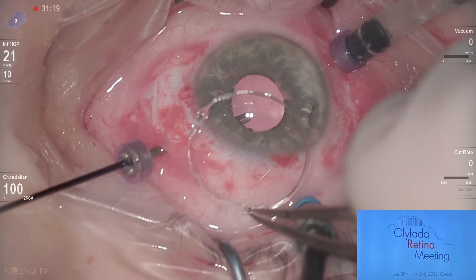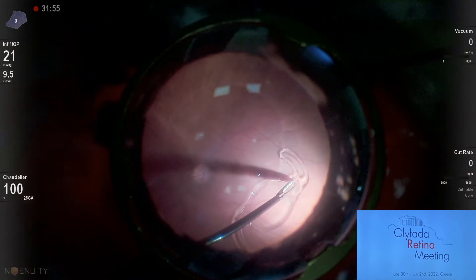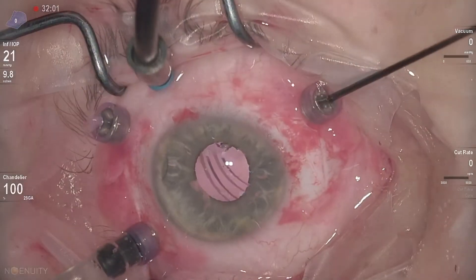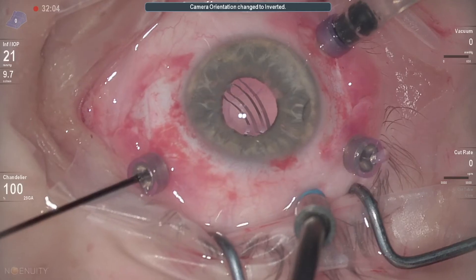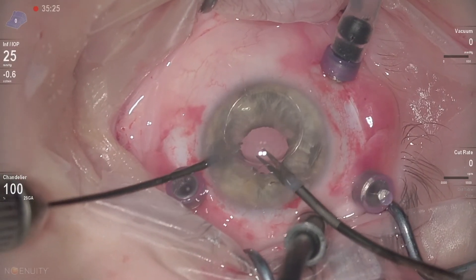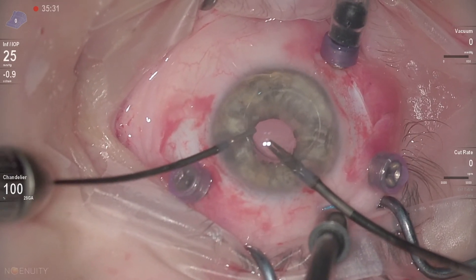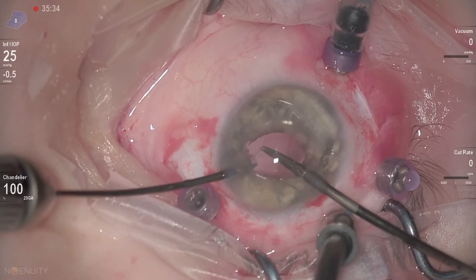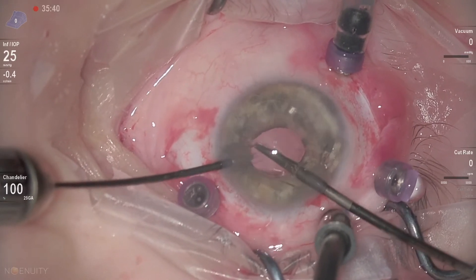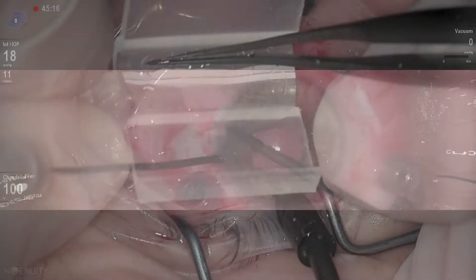The next step is extracting the IOL. I am using a crocodile forceps — this is my most reliable instrument; it holds and it doesn't drop. I will place the IOL in the anterior chamber and through a 2.2 mm incision I will remove the pieces of the IOL. Normally I cut it into three pieces to be removed through 2.2 mm, and it is important to have good micro scissors for cutting the IOL.